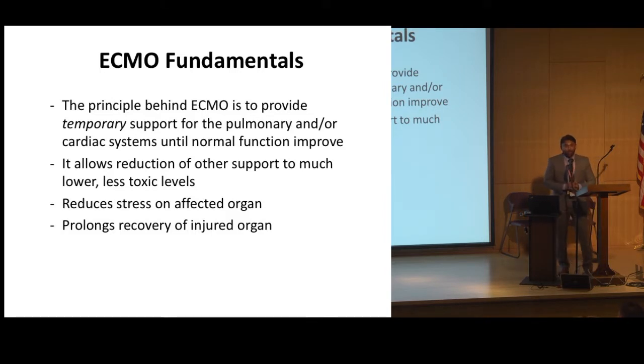So again, it's not a long-term support. It's very temporary. So you probably have days or maybe weeks. When we look at literature, I think the longest one was about 2 months, and that was it. So we're not talking about 3-4 months. The concept of long-term patients on ventilators and long-term patients on ECMO is 2 different things. So it's much shorter. Okay, so that's what it is. It's a bridge. It's temporary, and it's for short-term use.